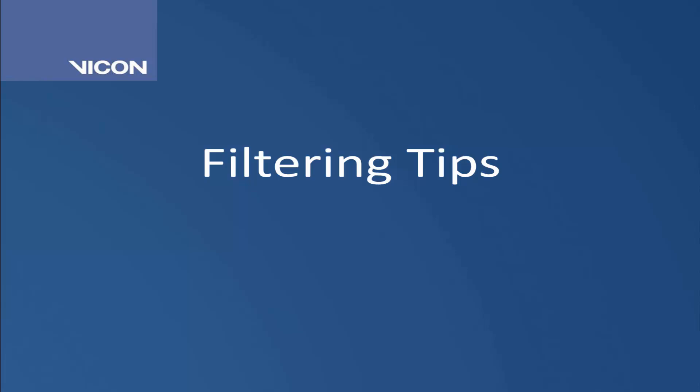There are a few other things to consider when using the filters. Firstly, only use a filter once. Over-filtering will result in a loss of real data.